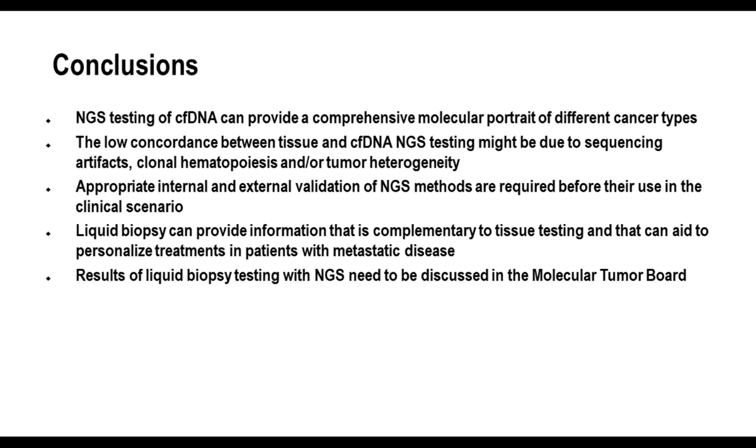I am convinced, and I showed you some data, that liquid biopsy can really provide information that is complementary to tissue testing and that can aid personalized treatment. The use of liquid biopsy is also very important to monitor the response to therapy, in particular in cases in which you may have a doubt of whether or not the individual will respond to treatment. But what I want to emphasize is that it's really important that the results of liquid biopsy tests with NGS are discussed within the molecular tumor board, because using these large panels, we quite often have quite complex scenarios that need appropriate interpretation.